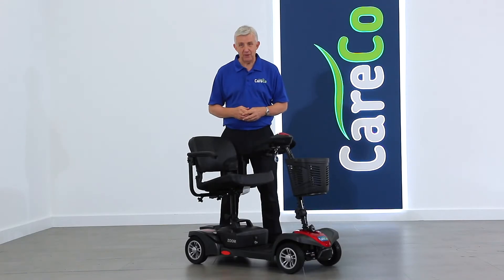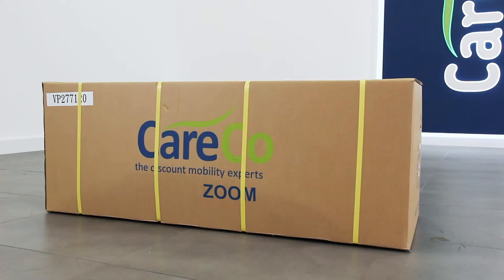Thank you for purchasing the Zoom travel scooter. We've put together this short video to help you with its assembly and to ensure that you get the very most out of your new Careco product. Your Zoom travel scooter should come fully boxed as seen here. Courier delivery straight to your doorstep is available from Careco.